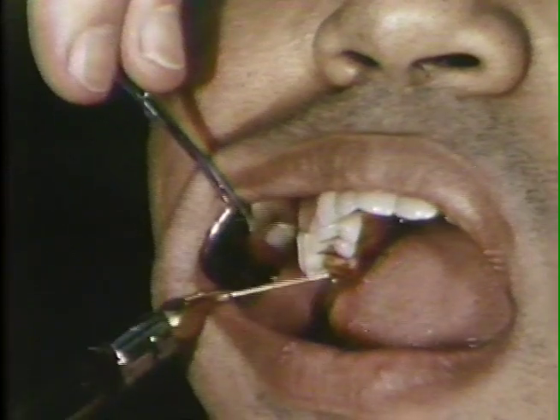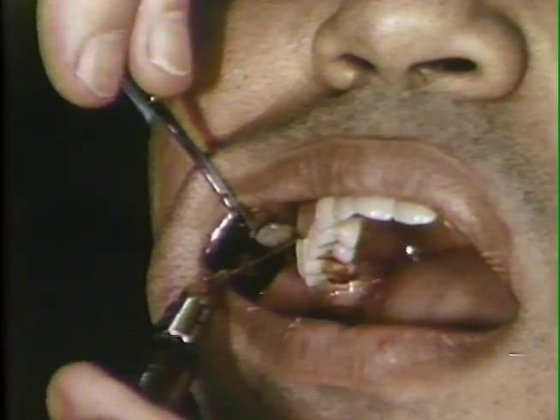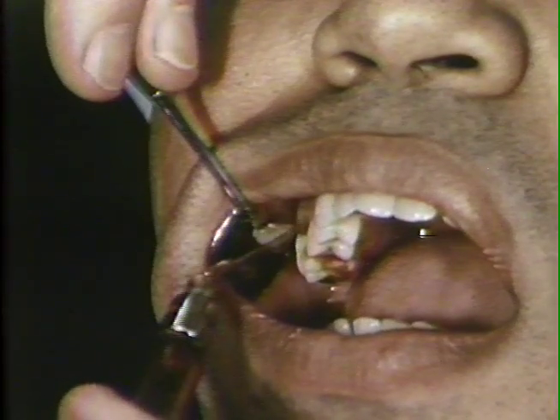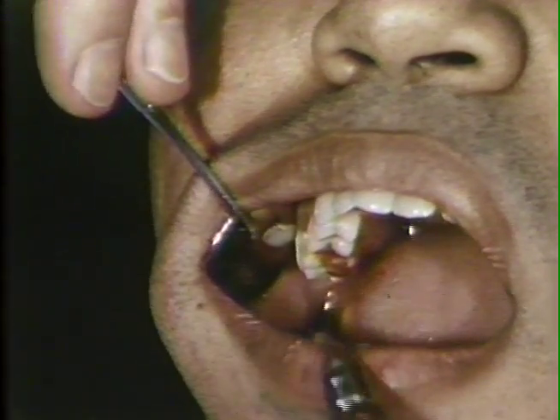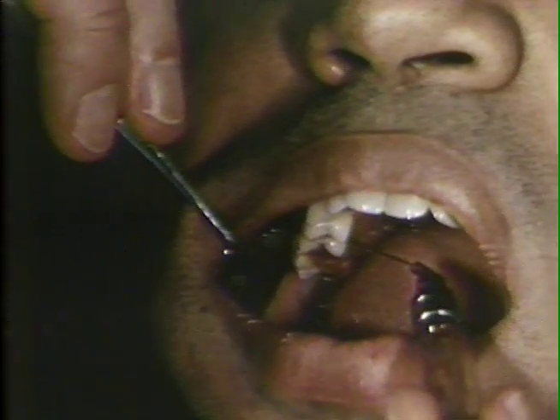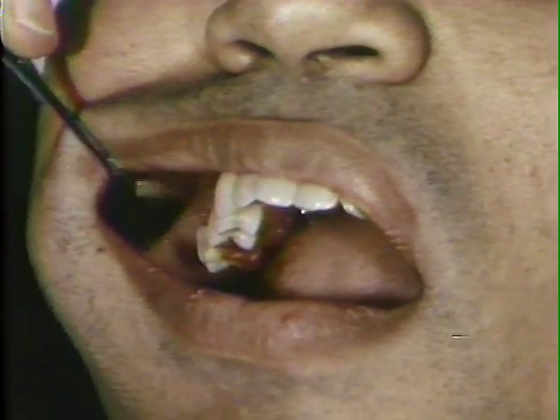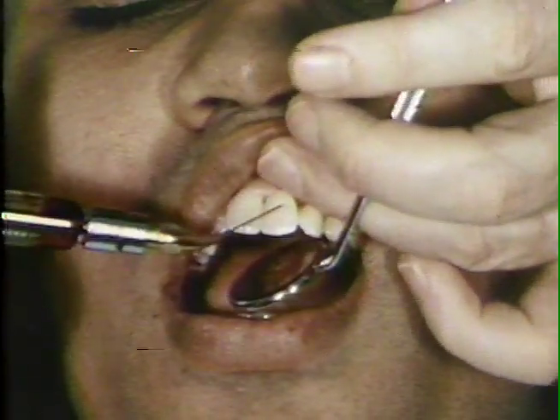After the completion of the scaling and root planing, iodine lotion should again be applied into the periodontal pockets to minimize the hazard of post-operative infection. The scaling procedure will now be demonstrated on the central incisor.